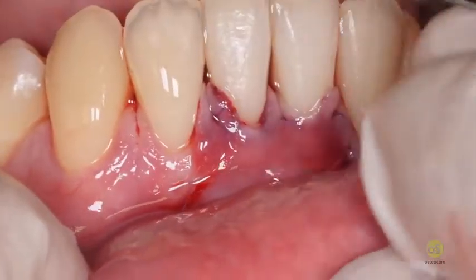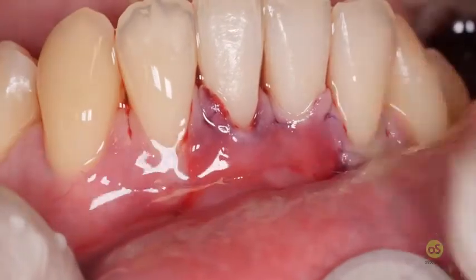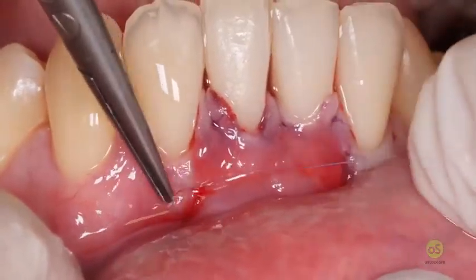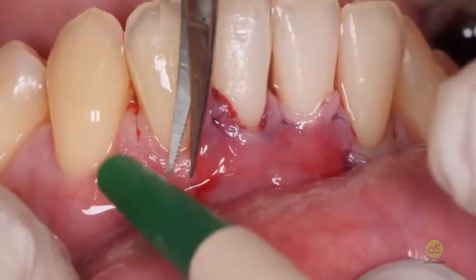All surgical knots must be displaced along the vertical releasing incision where you want to block your flap, not at the level of the adjacent tissue.